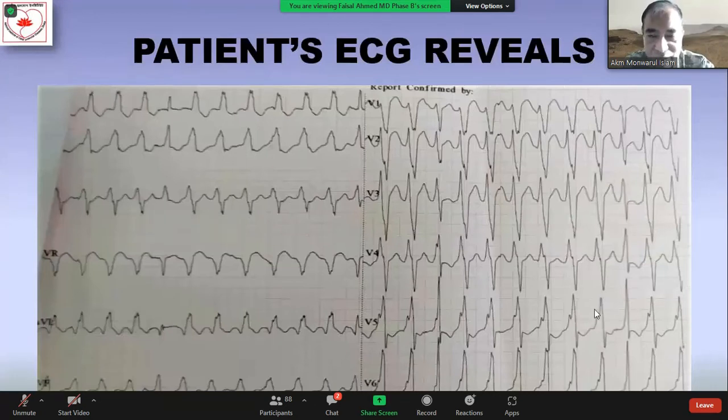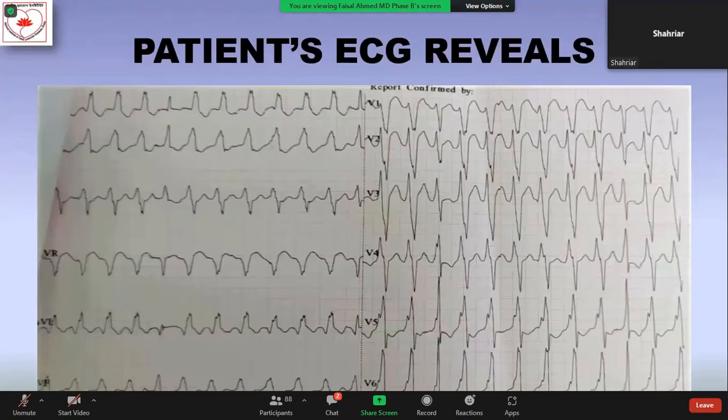And you know that sometimes a short note is given in the exam regarding Lewis lead. Dr. Munar, in our faculties, sometimes we are asked many questions about ECG, but we have some limitations, as we have less practice with ECG. So, for our convenience, to enrich our knowledge, I request you: please, can you define what is a capture beat and what is a fusion beat?